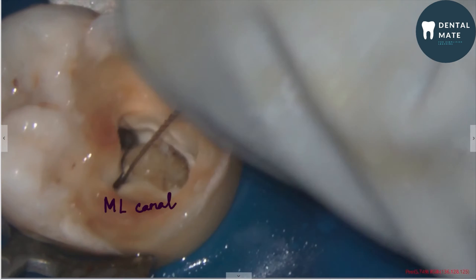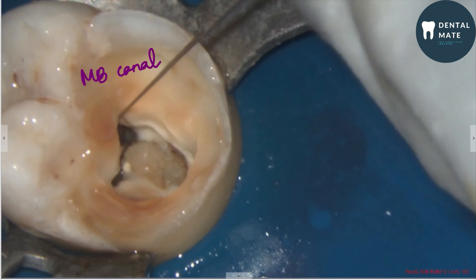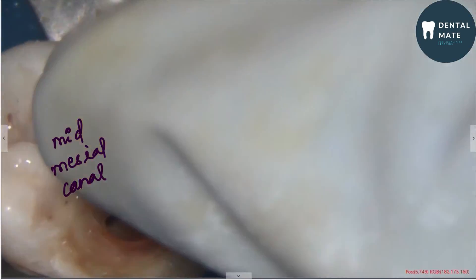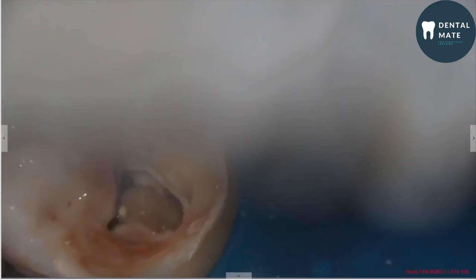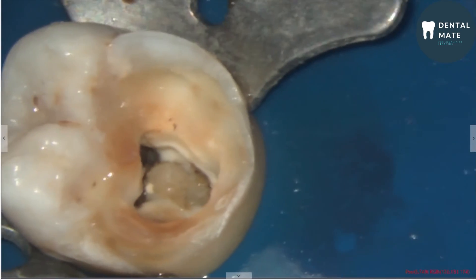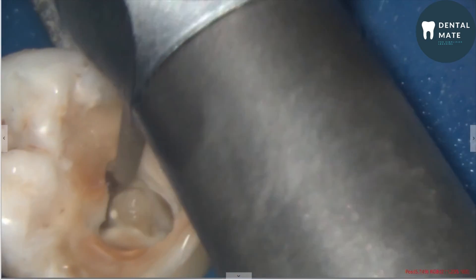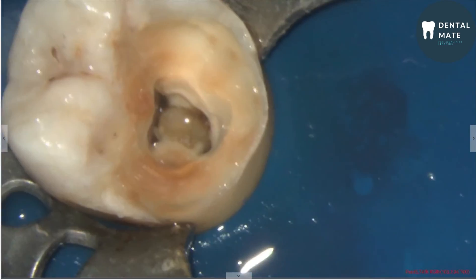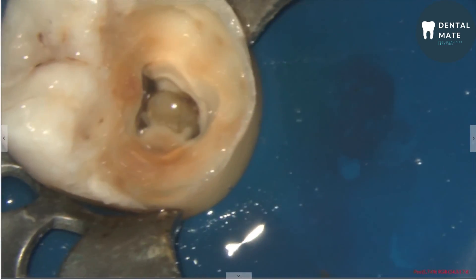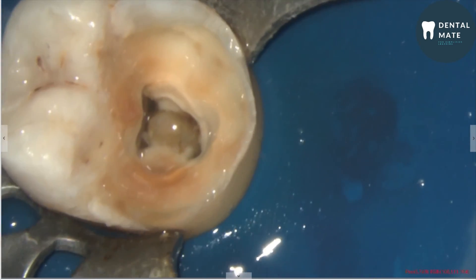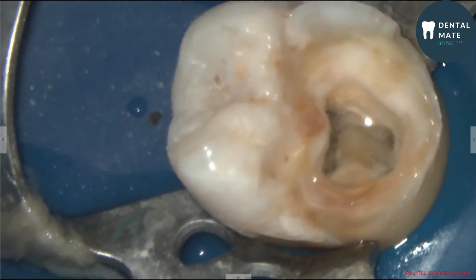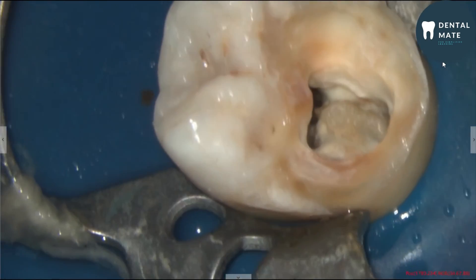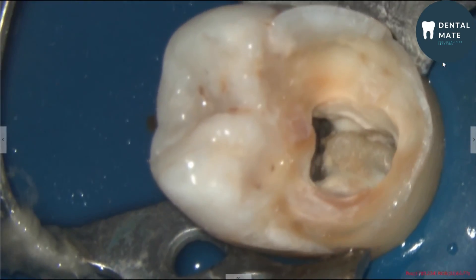This is the mesiolingual canal, this is the mesiobuccal canal, and this is the mid-mesial canal. It is always advisable to scout for the mid-mesial canal or the mid-distal canal while opening a mandibular first molar. I am slightly de-roofing the area around the mid-mesial canal, and here we can clearly appreciate the three mesial canals.